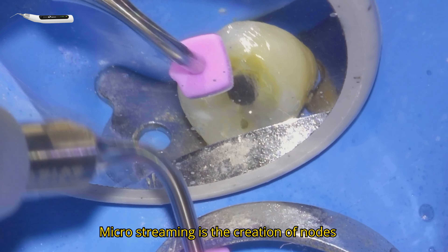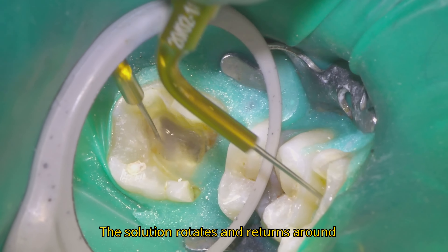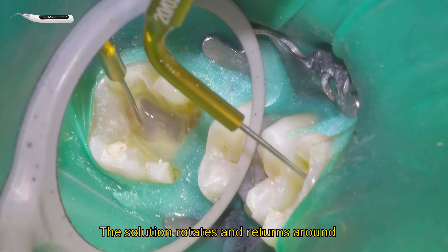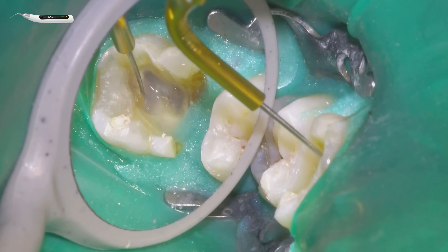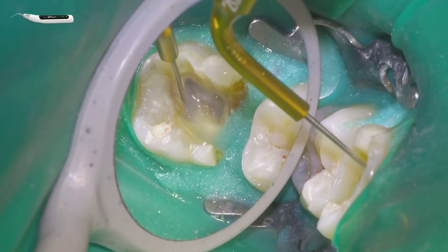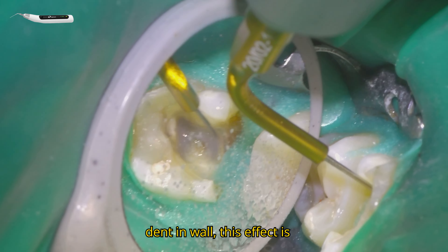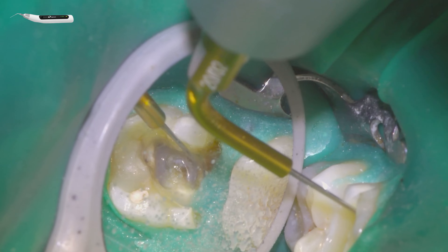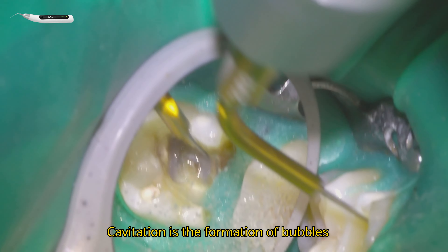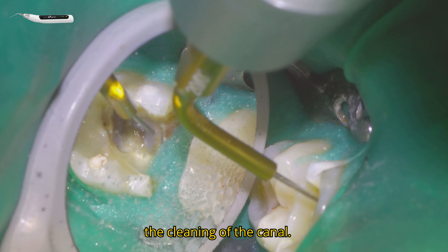Microstreaming is the creation of nodes and antinodes along the ultrasonic tip; the solution rotates and returns around the instrument, carrying the irrigant to the dentin walls. In curved canals, if the tip touches the dentin wall, this effect is significantly reduced. Cavitation is the formation of bubbles and their subsequent collapse, improving the cleaning of the canal.